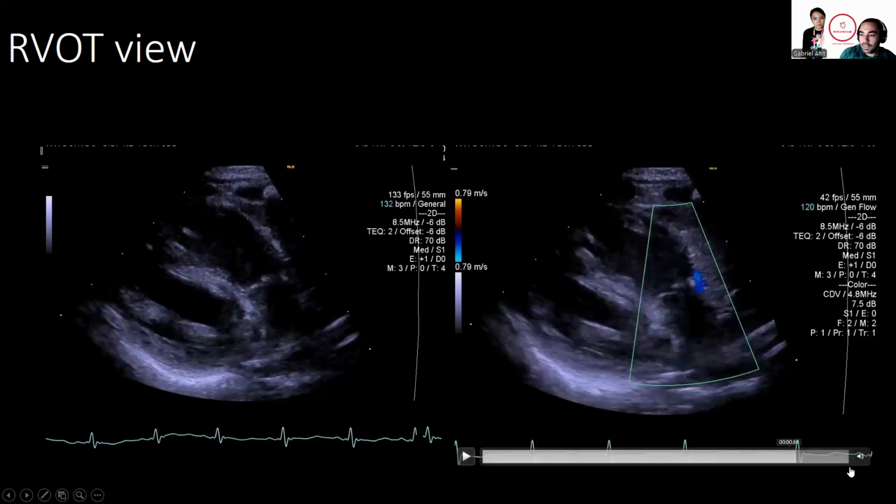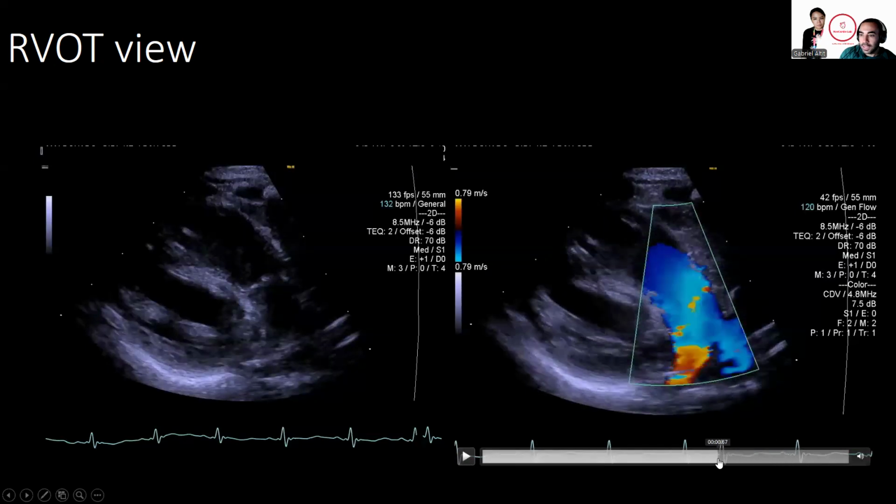In this particular clip, you can see here that there's a bit of redness, and that's not because blood flow is coming back towards the probe. It's because we get a phenomenon that's called aliasing. What is aliasing is that the different blood flow going here are quite turbulent, and they may be swirling, or they may go in different directions, which means that the machine at this point has difficulty capturing the true directionality of the bulk of the blood flow.